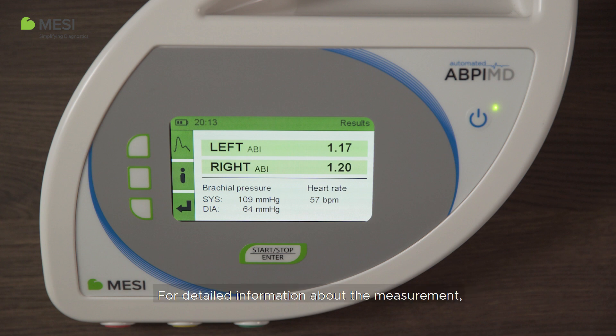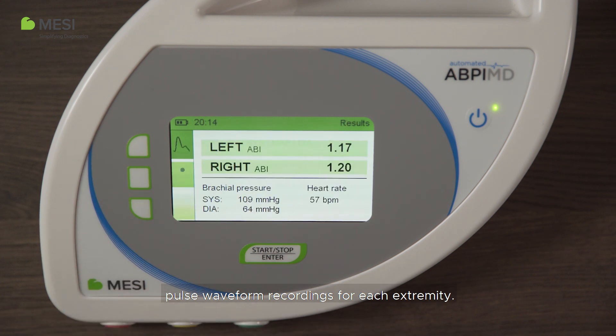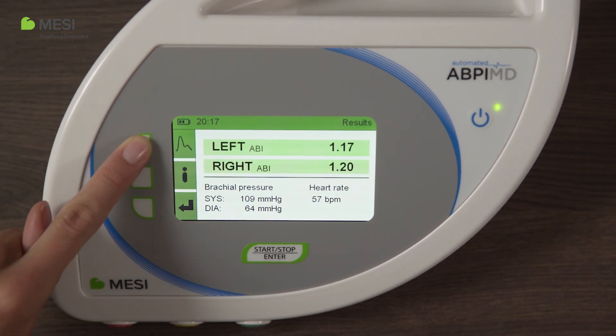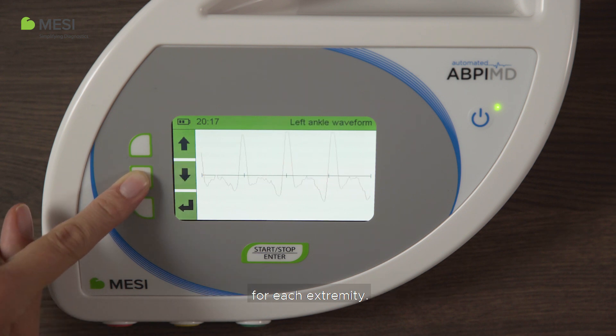For detailed information about the measurement, press the I button. The table with systolic, diastolic, and mean arterial pressures for each extremity will be displayed. The MACI ABPI-MD also provides pulse waveform recordings for each extremity. To display the pulse waveforms, push the pulse waveform button. This will allow you to analyze the waveform for each extremity.